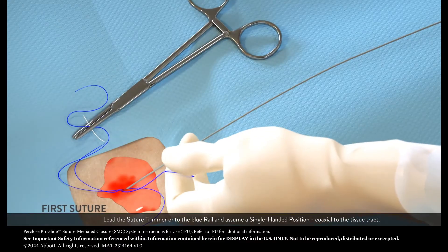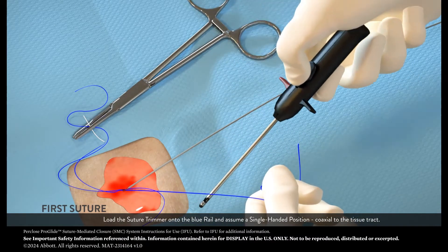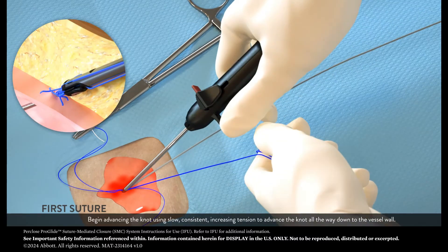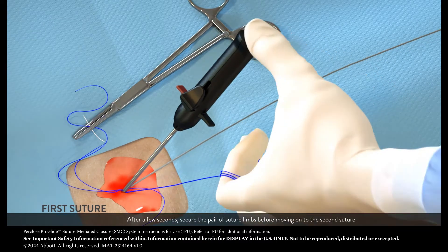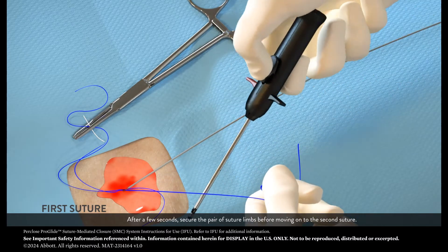Load the suture trimmer onto the blue rail and assume a single-handed position, coaxial to the tissue tract. Begin advancing the knot using slow, consistent, increasing tension to advance the knot all the way down to the vessel wall. After a few seconds, secure the pair of suture limbs before moving on to the second suture.